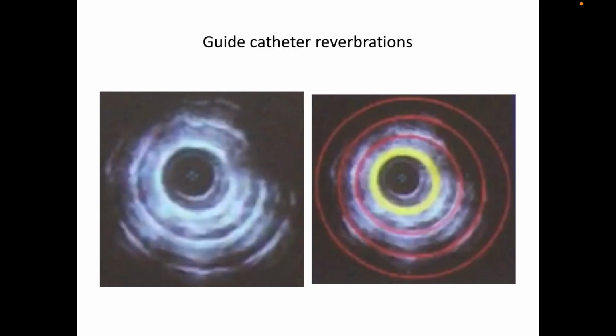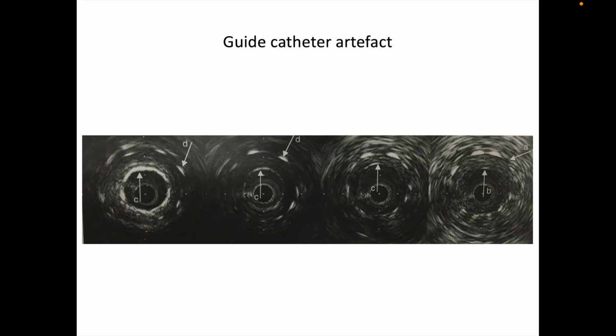So at times, not only we study the ostium while being pulled back with the IVUS catheter, but also while going into the coronary ostium. So if it's the left main ostium, I will record it while the catheter is going in, and I will record it while the catheter is coming out, because for the ostium you need the guide catheter to be disengaged and good axial orientation of the guide with the coronary ostium, and then this in and out technique to assess the ostium properly.